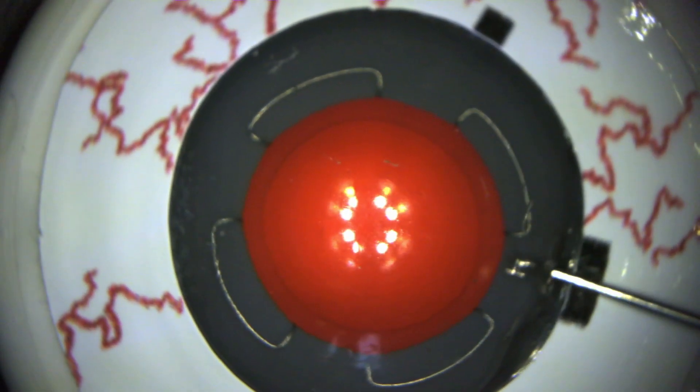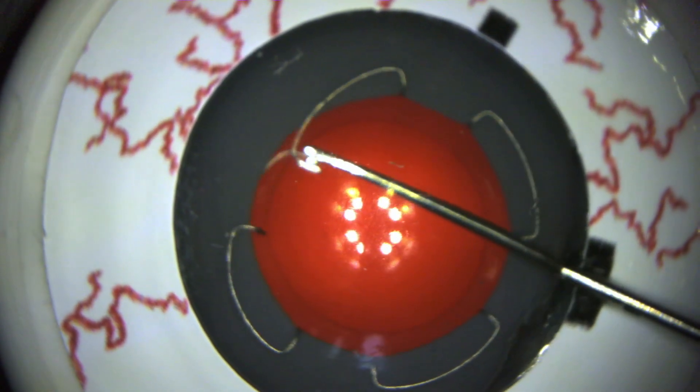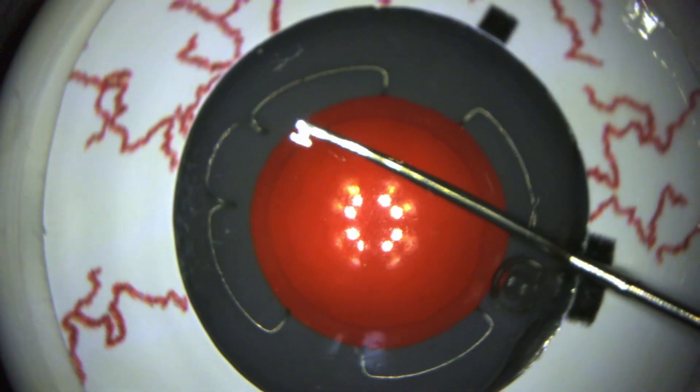With the use of the manipulator, you're going to start by disengaging the distal foot first, grabbing the shoulder of the device, lifting up and out.